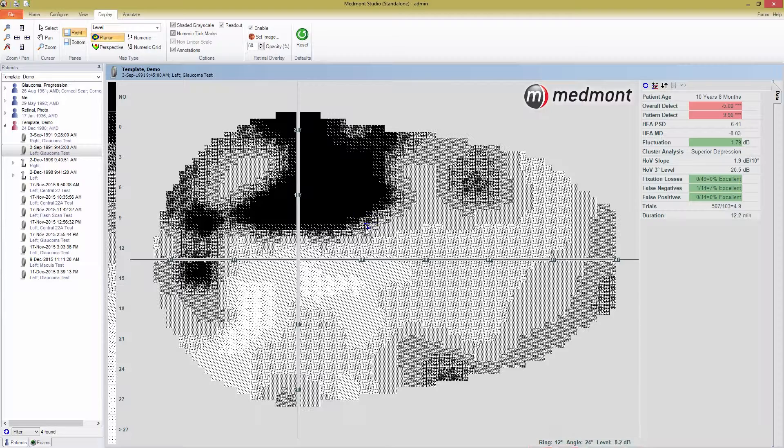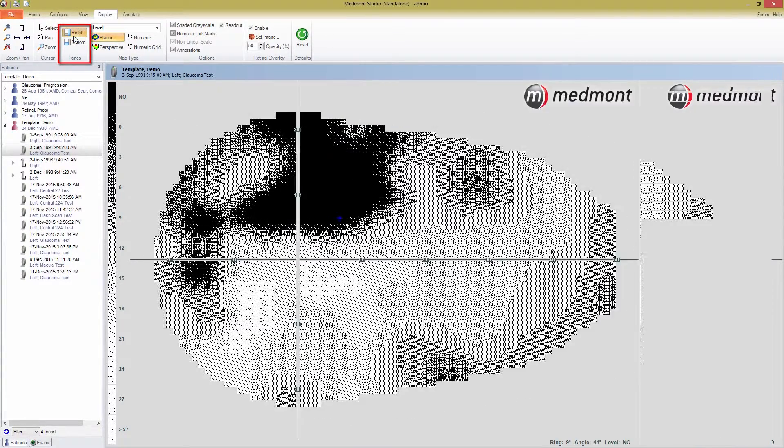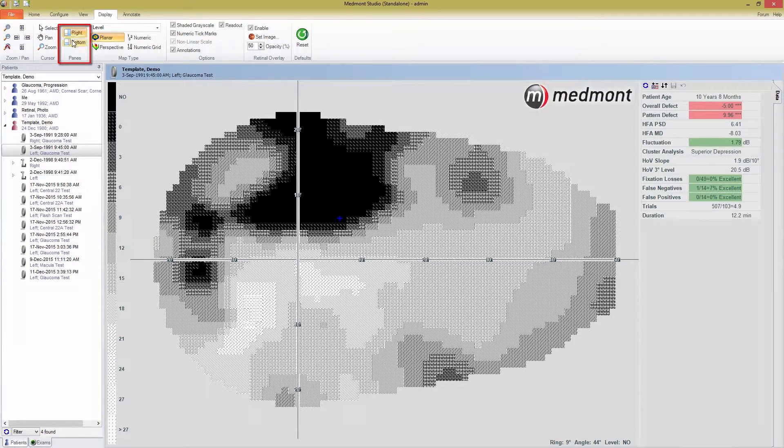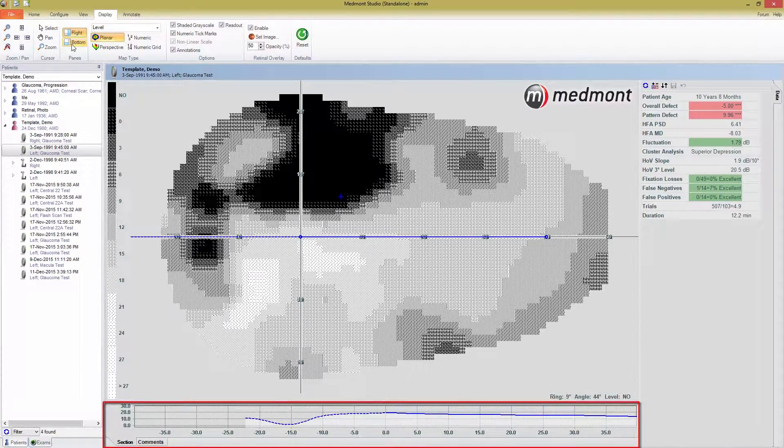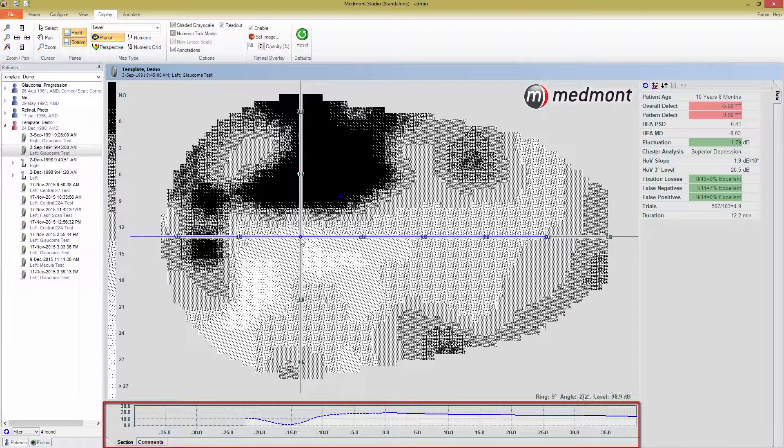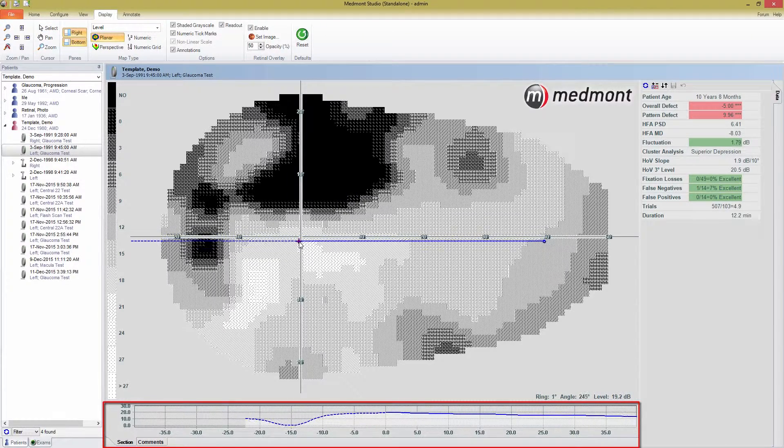The Panes section of the toolbar allows you to toggle on and off the right and bottom data panes. The right data pane shows all the test attributes, while the bottom pane gives the 2D cross section of the data. You can change where the map is sectioned by choosing the select cursor and moving the blue line on the map.